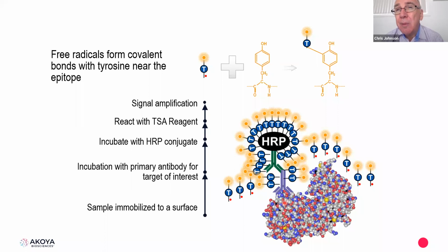It also depends a little bit on the tissue itself, whether it's lung or liver or spleen. All these will have some effect on where the spectral position will shift to. So I personally prefer to measure my libraries from the sample itself.